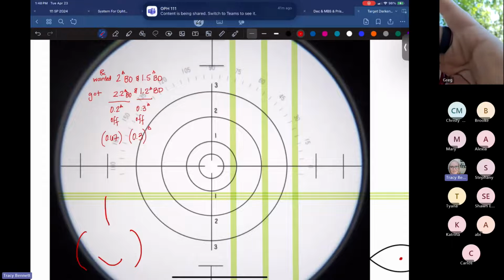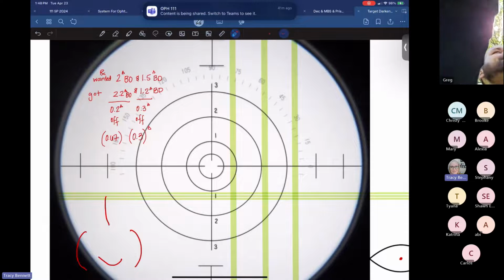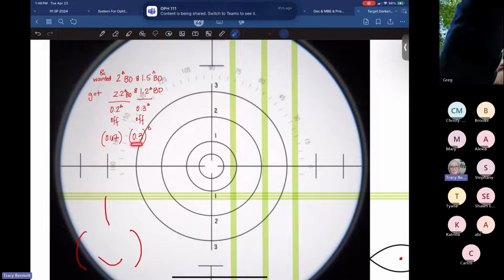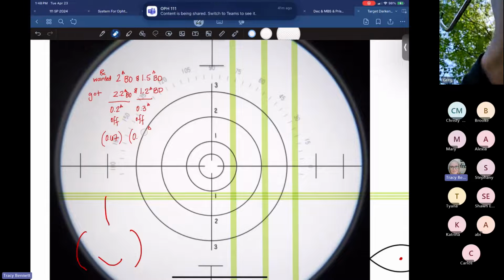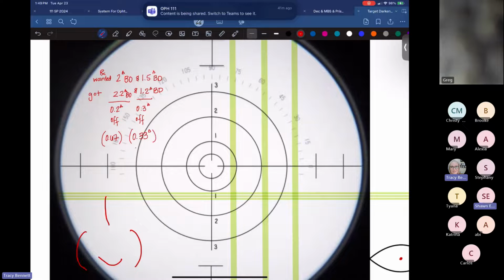I would like to point out that we would also need to see what the other lens is, because this one we've applied correctly, vertically, we're only allowed to be off by 0.33, but that's in one lens. With the horizontal, we're allowed to be off a third in each eye, so that 0.67. We'd have to see what the other eye was doing.